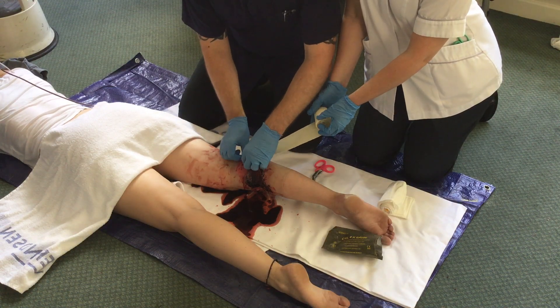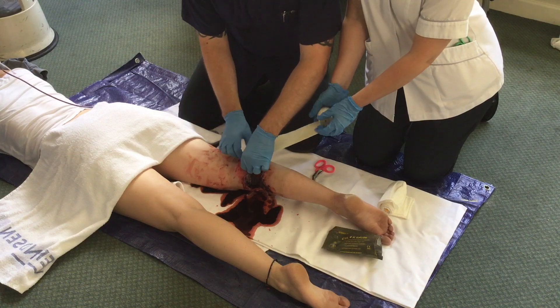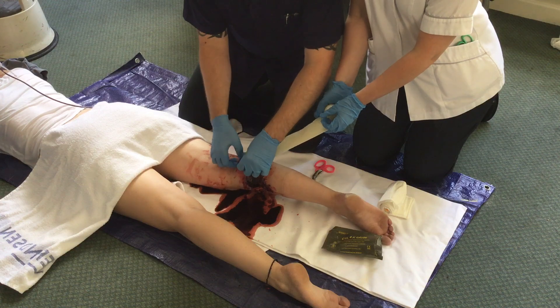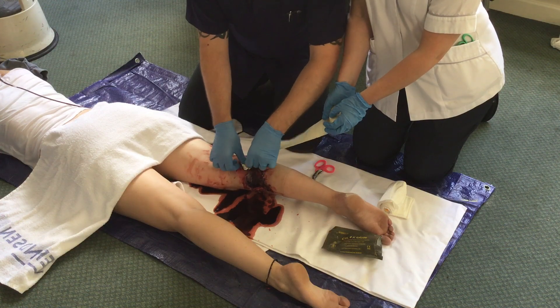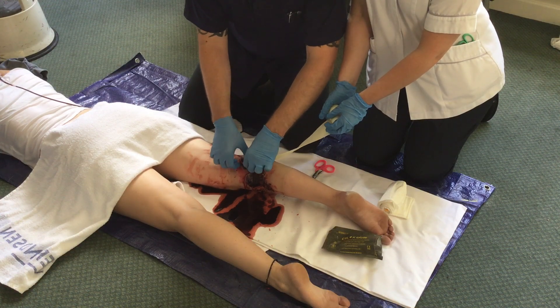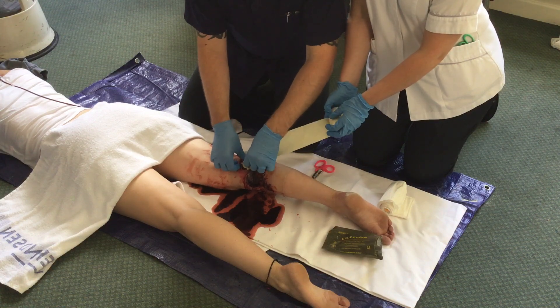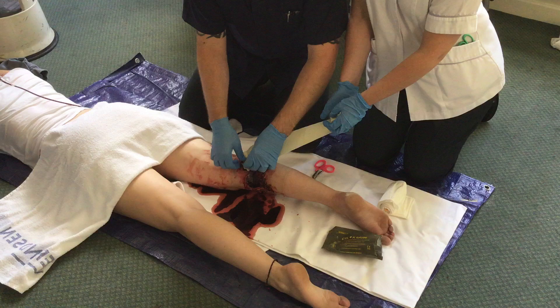The primary operator fills the wound, pushing the gauze in as deep as possible and folding the gauze on top of itself as the wound is gradually packed from the bottom to the top. Pressure is applied constantly while this procedure is being carried out.